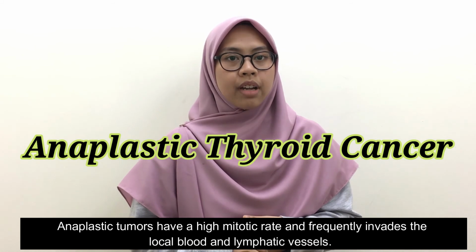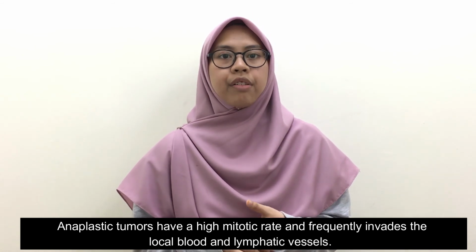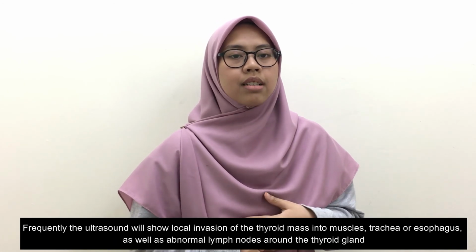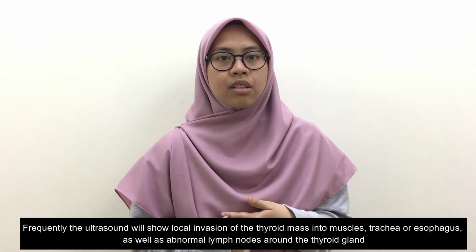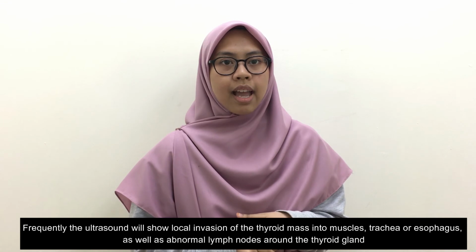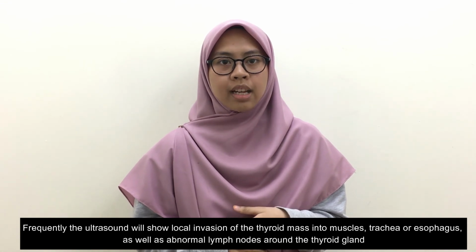Anaplastic tumors have a high mitotic rate and frequently invade the local blood and lymphatic vessels. Frequently, the ultrasound will show local invasion of the thyroid mass into muscles, trachea or esophagus, as well as lymph nodes around the thyroid gland.